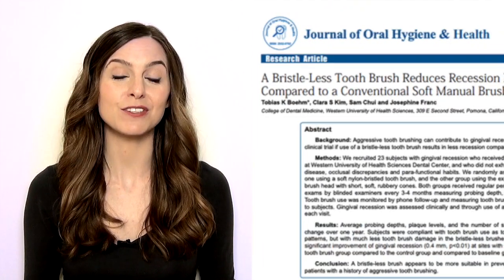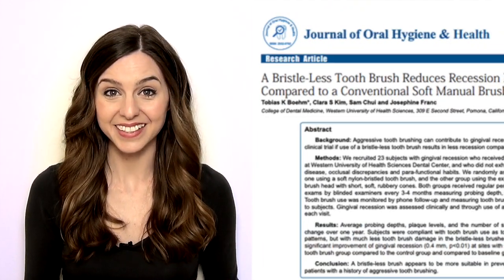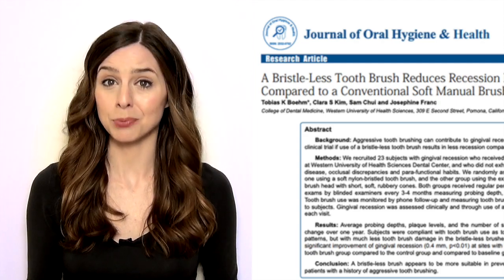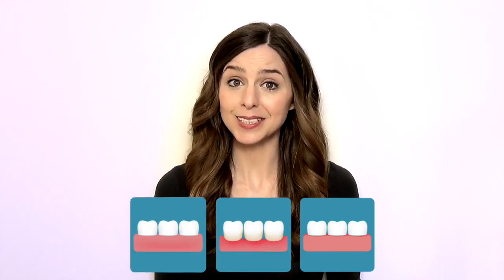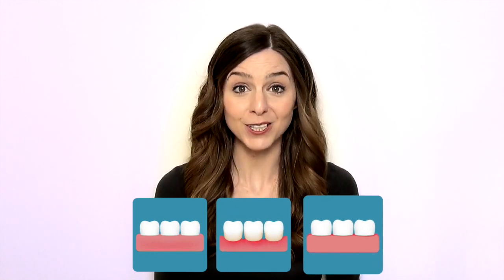Recent research by the Western University of Health Sciences in California is suggesting that by using a bristle-less toothbrush, gum recession can be prevented, halted, and in some cases, partially reversed.